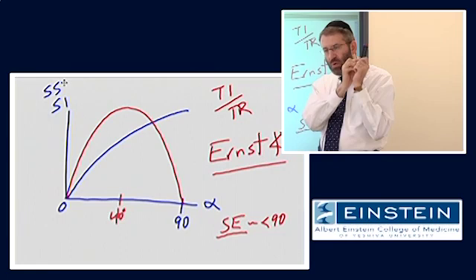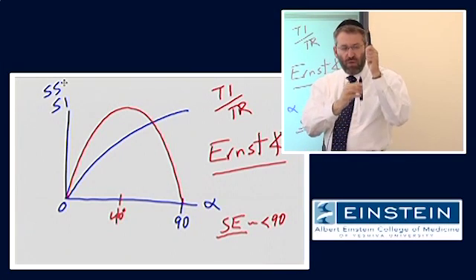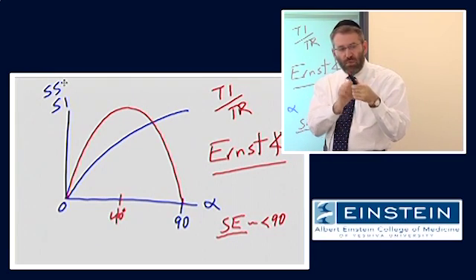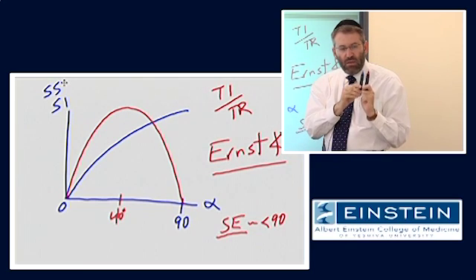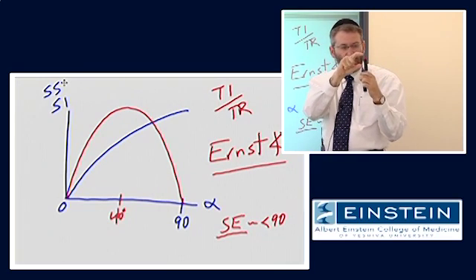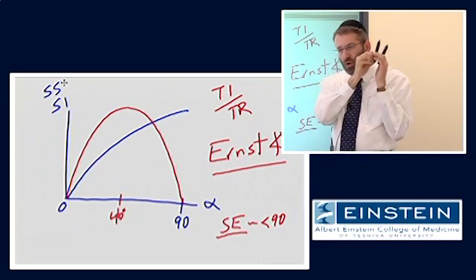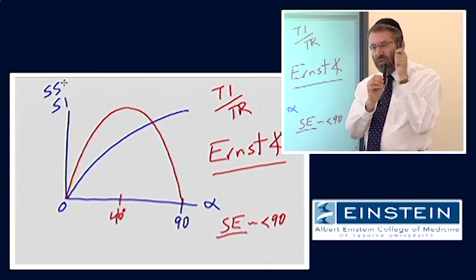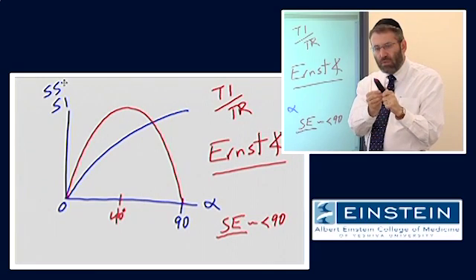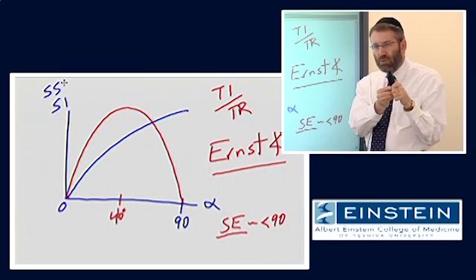They have different T1s, but it's only when we knock them down all the way and they have this long way to recover that when they relax at different rates, we can see a large difference which gets turned into signal. Otherwise, if we only knock them down part of the way, they're already half the way home. There isn't going to be that much time for them to differentiate during that recovery of longitudinal magnetization. And as a result, there's a smaller difference which we turn into signal with our narrower flip angle. So by using a larger flip angle, we essentially bring out these differences based on different T1 relaxation times. Whereas with a narrow flip angle, there's only a little bit of difference between these spins based on their T1 relaxation time, which we then turn into signal.